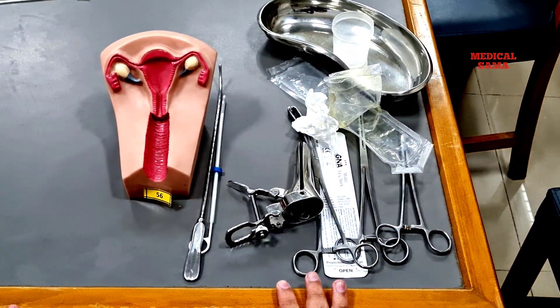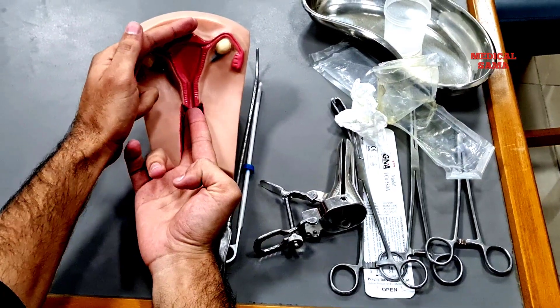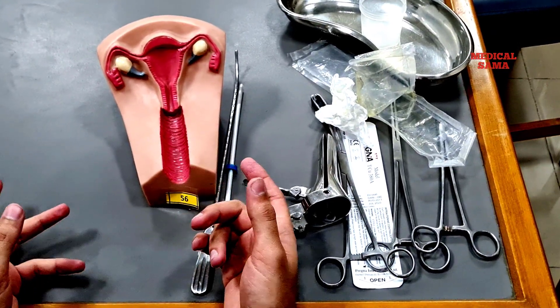Now first of all, you should perform a bimanual examination to check the position, size, and any abnormality — like adnexal mass or any growth in the vagina or adjacent to the vagina.